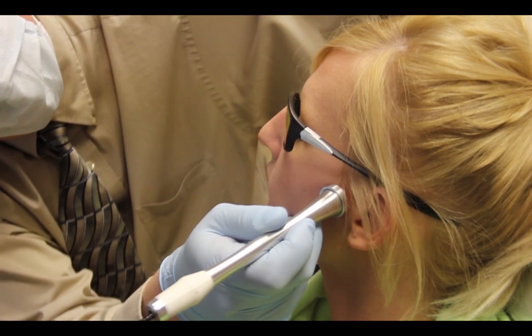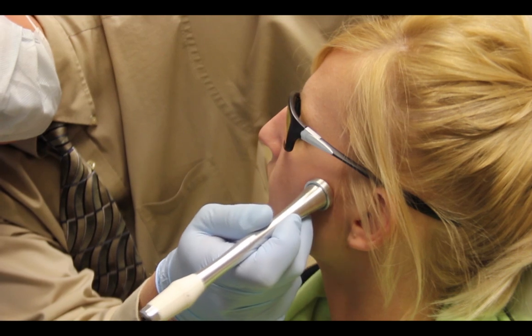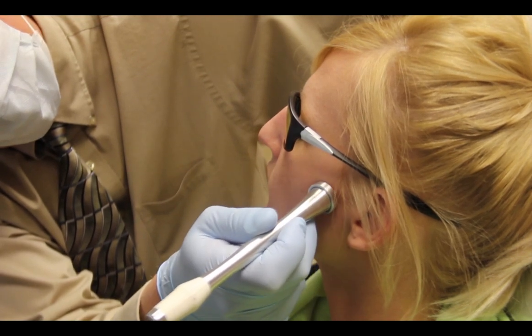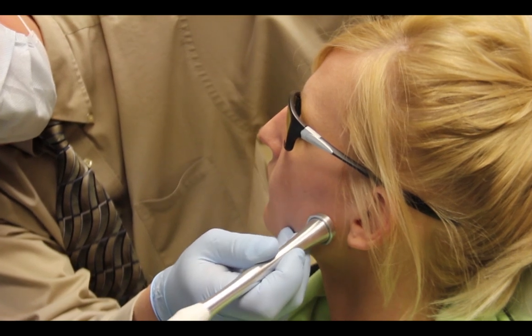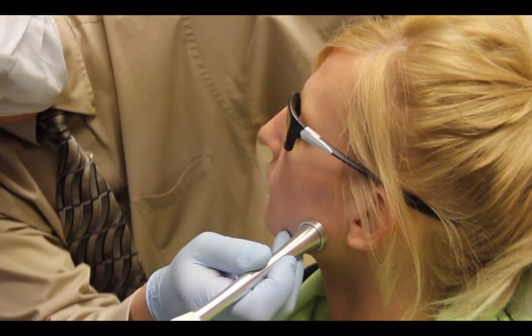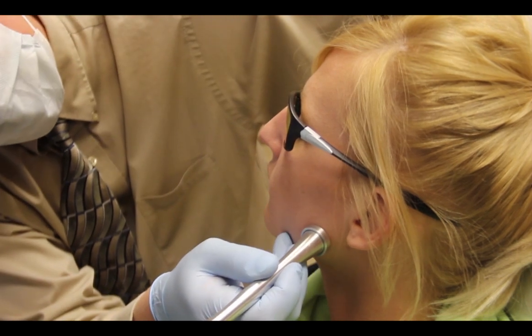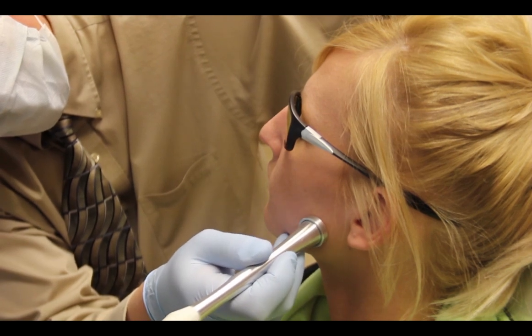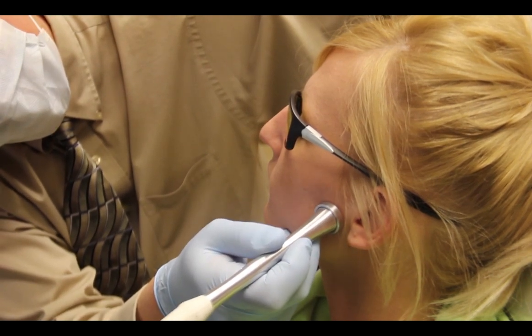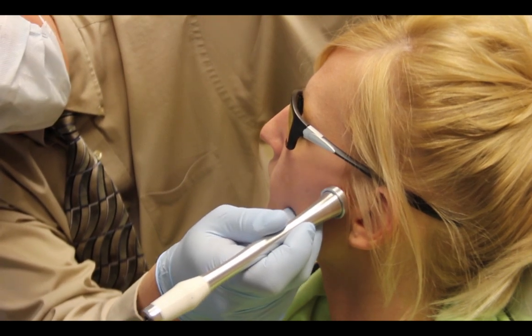But what's it actually doing? Low level laser therapy actually increases cellular activity, decreases the inflammatory response of the body, and helps increase blood flow to the affected area. This feels good — the patient may report a slight warmth in the targeted tissue areas, but that's it, and they should exhibit immediate relief upon finishing.